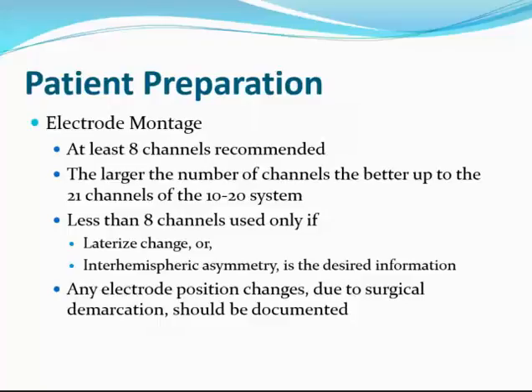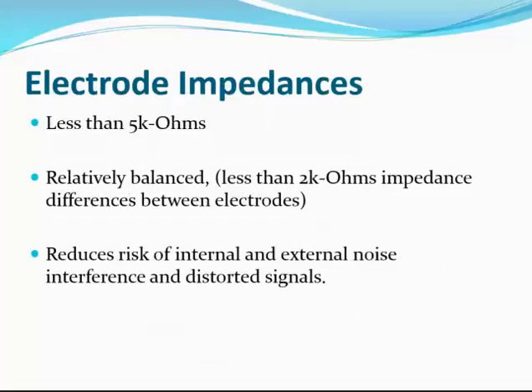If they're doing a temporal resection for epilepsy, for example, you're not going to be able to get to T4, because that's where they're going to be working. So that has to be documented, so that your record is speaking the same language as you would want it to speak when you were in the OR.